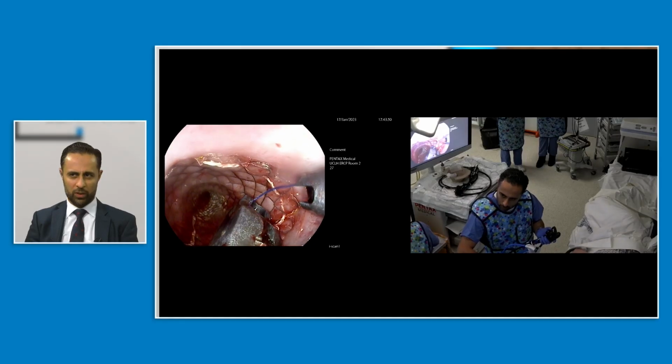The case that I will next present is a patient who had a benign esophageal stricture, a refractory benign stricture, which I know is slightly off the cards in today's talks, but this is a patient that had failed numerous dilatations, and also had failed steroid injections. So she agreed to have a temporary esophageal stent, and in these cases I would elect to suture these stents in place to reduce the risk of migration. So can we just play that video here?